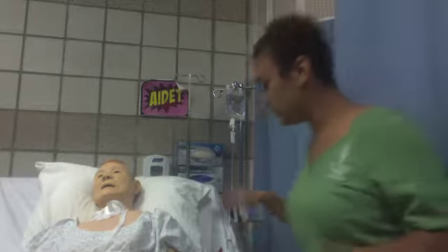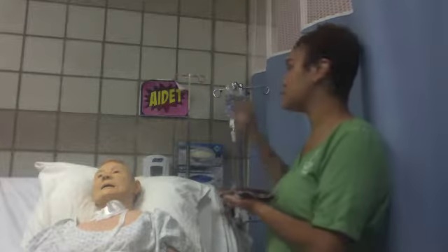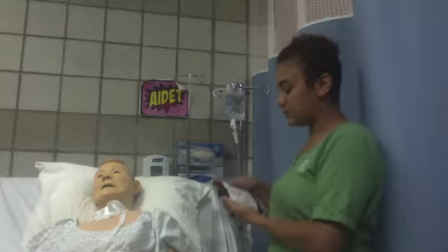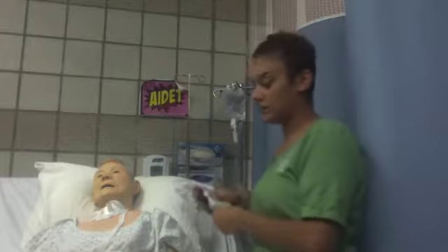call the blood bank. So the blood bank comes, they bring us the blood. I verified the expiration date on the blood. We've verified expiration. Saline is still running. We verified there's no clots, no clumps, no formations. We verified that the color and consistency is where it needs to be, that the type is AB, RH positive, that it is correct to everything that we have.